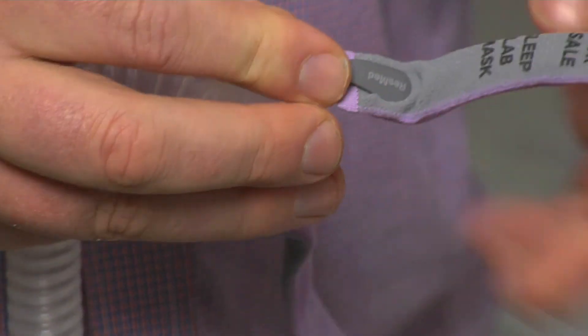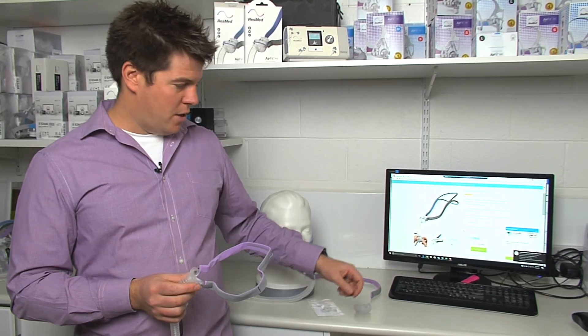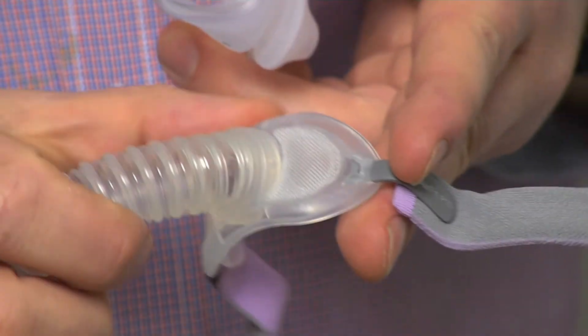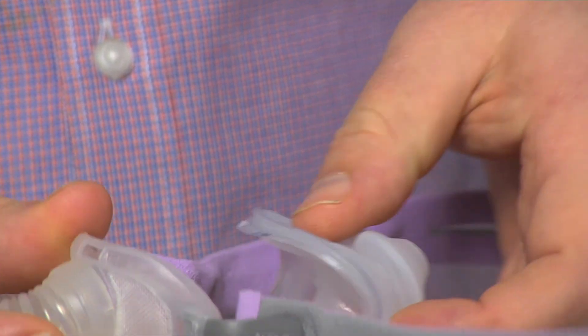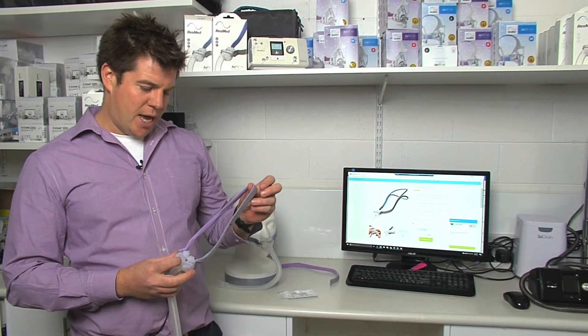And there we go — nice and simple. The next step is to insert the pillow. There are two sizes with the clip: a small one and a large one. Make sure that they connect up properly with the mask here and here — the small one on the top, the big one on the bottom. And click — your mask is now ready to use again.